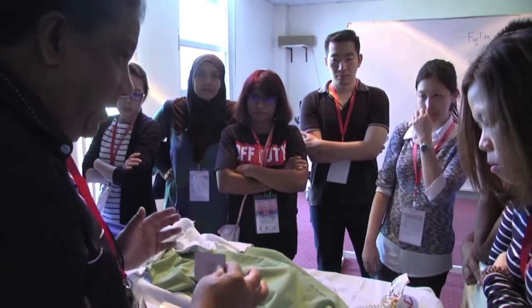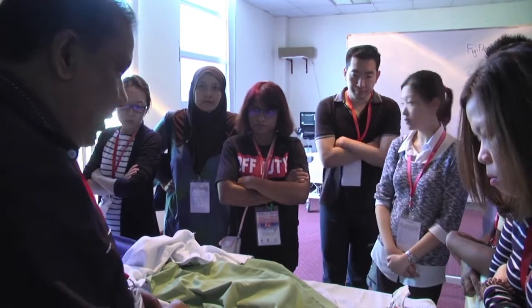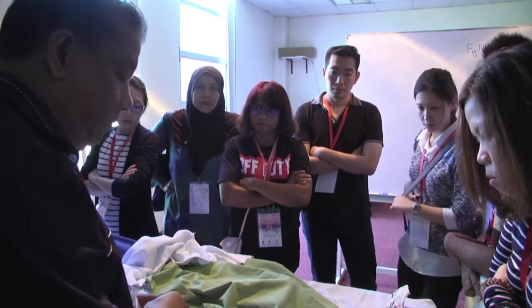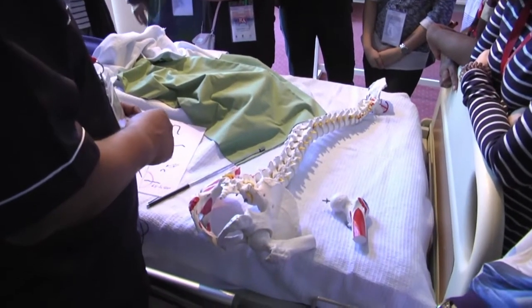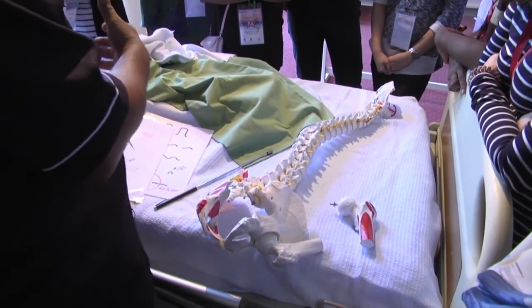Finally, it's important to understand that while you can image the spine, it's not really necessary to do real-time interventions on a day-to-day basis. The information that you can accumulate by doing a preview scan gives you a wealth of information that you can use to supplement your skills.